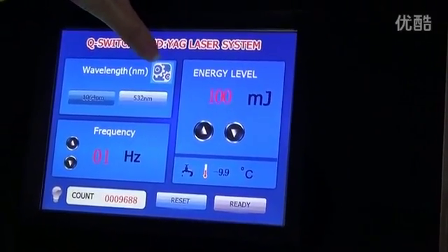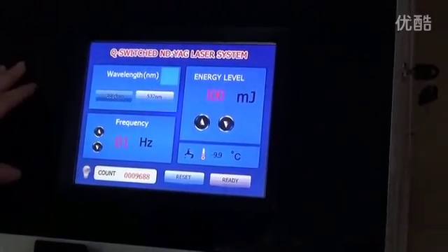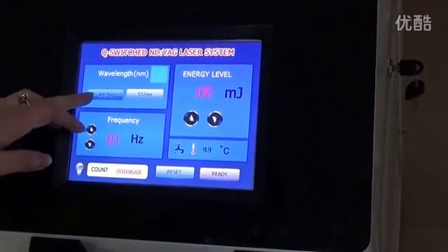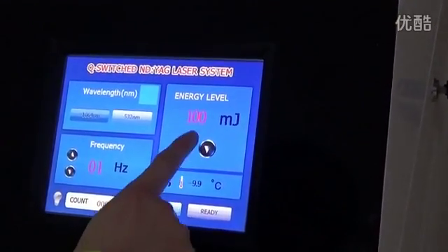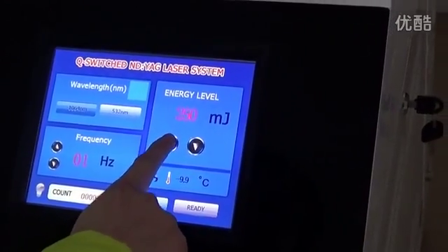At this time, this picture will show. After it disappears, now it is 1064 wavelength, and this is the energy. 100 is the smallest, and you can increase it.